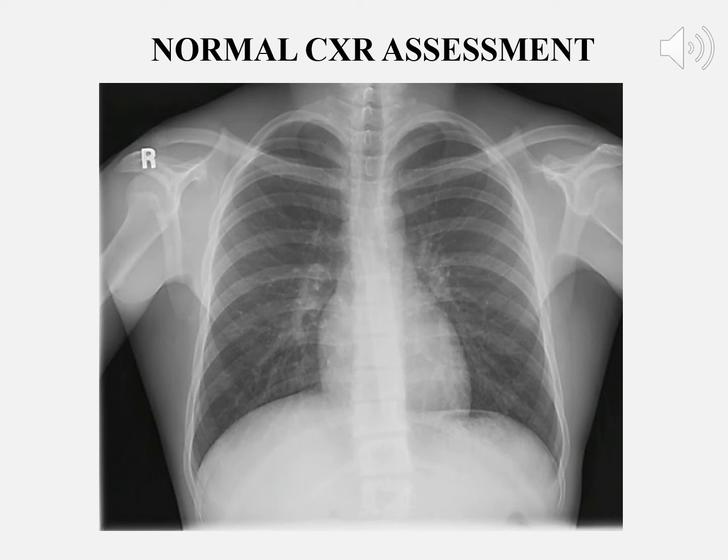So, in today's world, we think, well, I looked at it, but this is going to be read by a radiologist, and he or she will catch it, and that's the safety net. It may be true, however, what if this patient has a ninth left posterior rib fracture that you miss, the radiologist misses, they have a bad outcome, 1 week later they have a tension pneumothorax, and they die from it, or just have a bad outcome. Then you perform malpractice because you didn't interpret and relay that information correctly. You didn't correctly read that X-ray. So know that you're responsible for everything on that image.